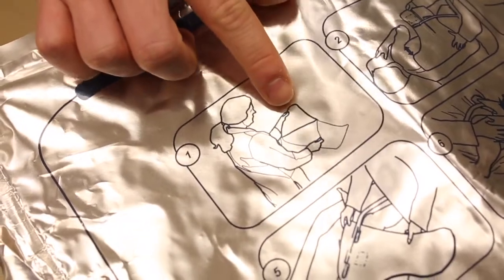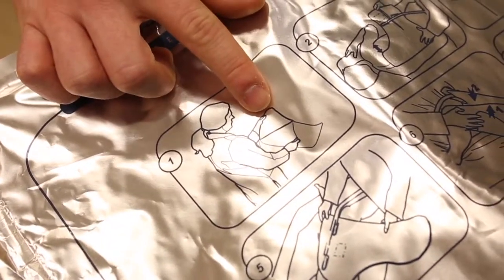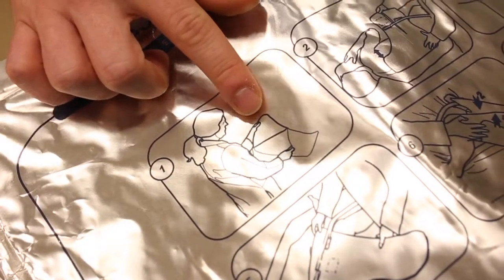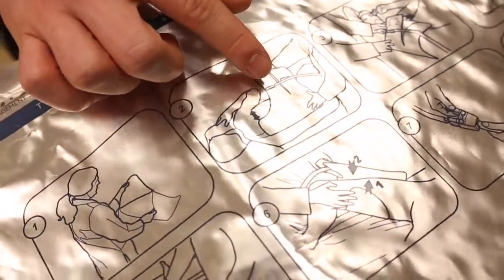These are the medium pads. Pull them out of the packaging and remove the protective cover on the adhesive. There are four pads: two for the thighs and two for the back and chest.